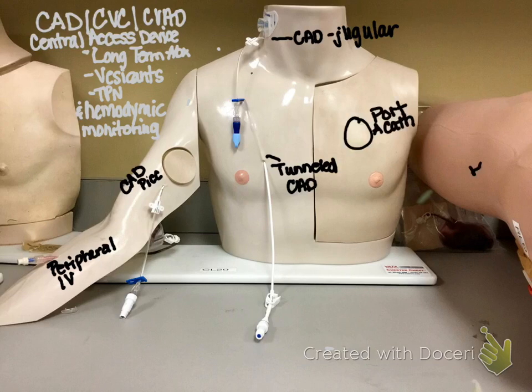Also, I've got you a portacath labeled. You can't see it, it's under the skin, but our next slide shows you the portacath, how it actually looks.